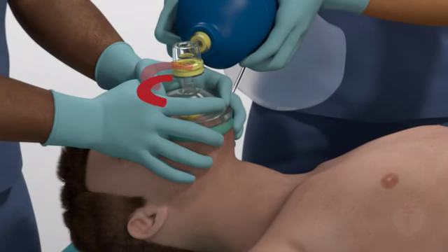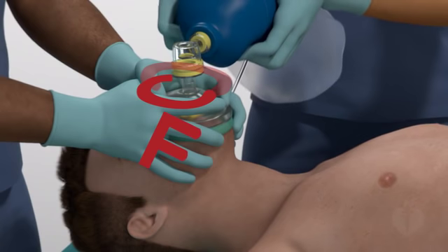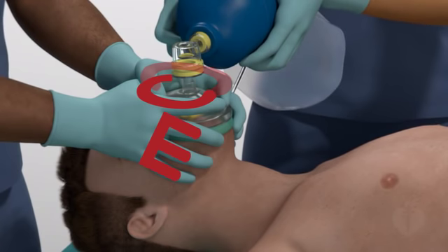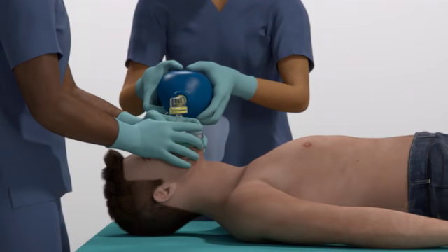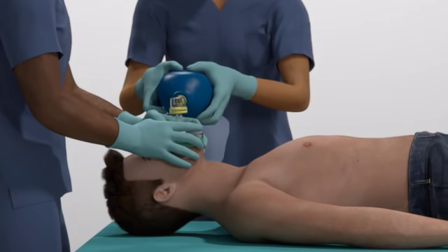The thumbs and index fingers of both hands each form a C, ensuring a good mask seal against the face, with the 3 remaining fingers of each hand forming the E, lifting both sides of the jaw into the mask. The second provider squeezes the bag, enough to cause visible chest rise. When using a bag mask device, whether there are 2 providers delivering breaths or just one, be careful not to press too hard on the mask, which could push the patient's jaw down and obstruct the airway.